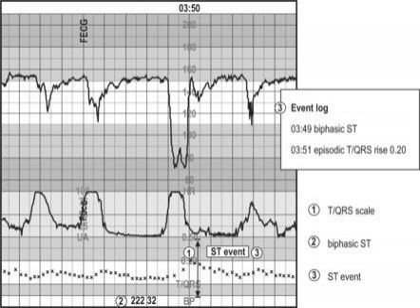This approach added to our ability to identify hypoxic fetuses, but the false positive rate was still too high. In addition, it required special equipment and training and came with its own complications. The discovery of scalp stimulation has eliminated the need for scalp pH and its complications, but still, neither is specific nor sensitive enough to add much to our treatment algorithm. So how do we remove all of these levels of abstraction? Well, we need to measure the fetal oxygenation status directly.